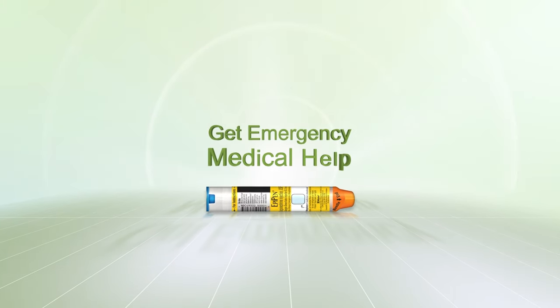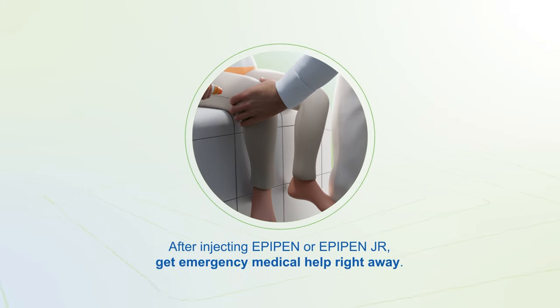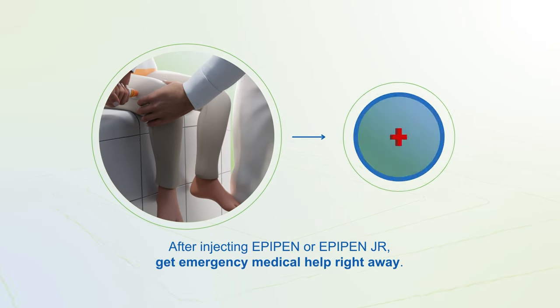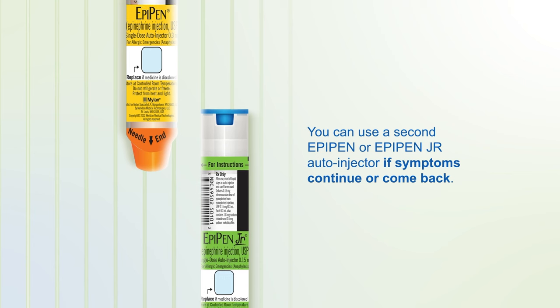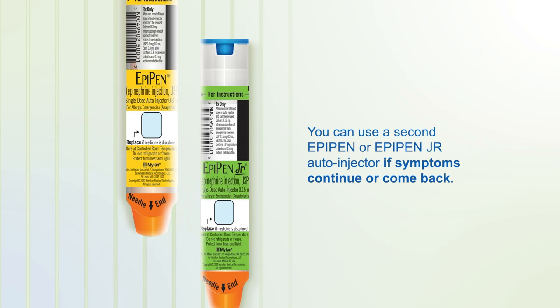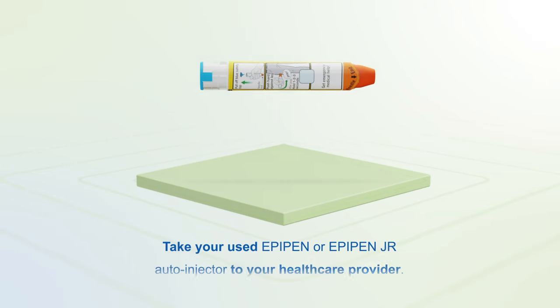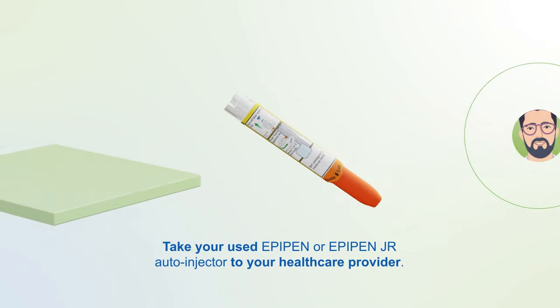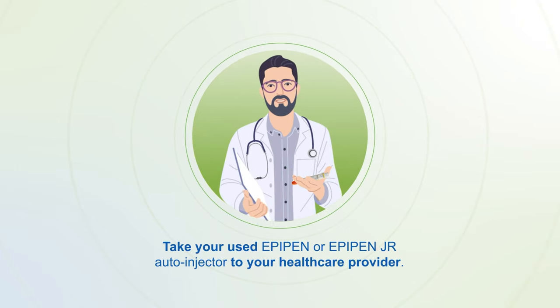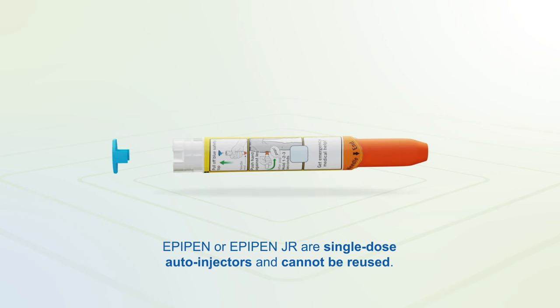Get emergency medical help. After injecting EpiPen or EpiPen Jr., get emergency medical help right away. You can use a second EpiPen or EpiPen Jr. auto-injector if symptoms continue or come back. Take your used auto-injector to your health care provider. EpiPen and EpiPen Jr. are single-dose auto-injectors and cannot be reused.